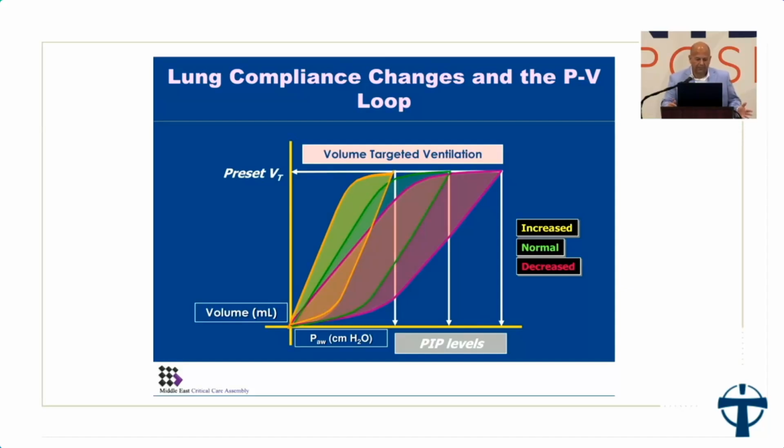If you look to the left, it shows what's more in your normal range, and then as it shifts to the right, you have decreased compliance. So that's one thing to remember. If you have ventilators that have flow or pressure graphics, turn them on, and if you know something about it, maybe educate the rest of your team, because it is really beneficial to know.